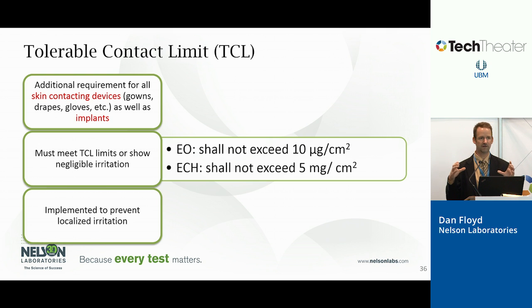So it's based on the surface area of the device. And that's just to prevent any localized irritation, because if you have too high levels of ethylene oxide or ethylene chlorohydrin, they could cause the patient to have irritation. So it's an additional requirement that was added.